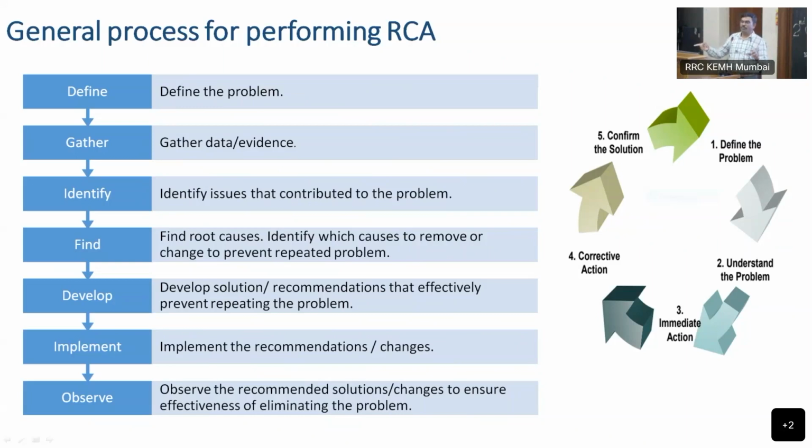And when we changed the logistic group completely, we reverted back to our mainstream results of multiple of median tests. We started releasing accurate reports for that. So I found the root cause, and then we made the recommendations based on our findings.